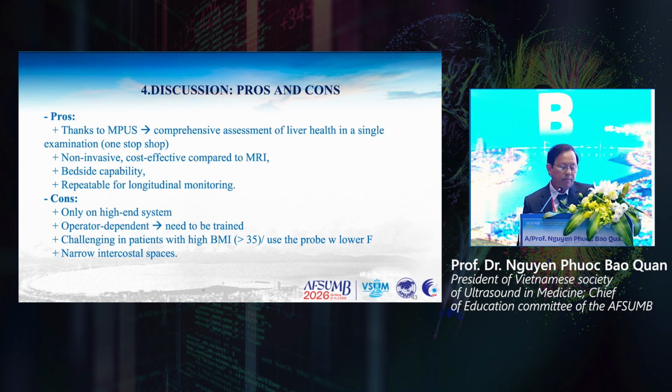The techniques are non-invasive and cost-effective compared to MRI or CT. And we can carry out multiparametric ultrasound at the bedside of the patient, and we can repeat it many times when we intend to monitor the patient.